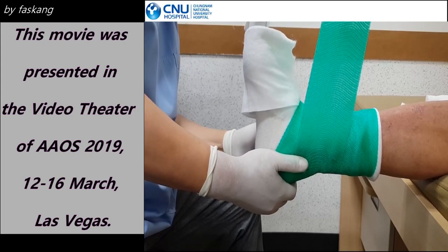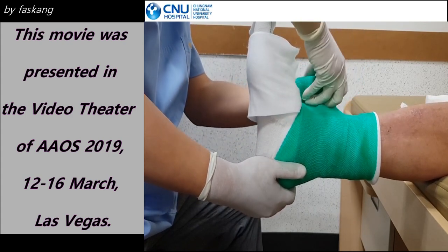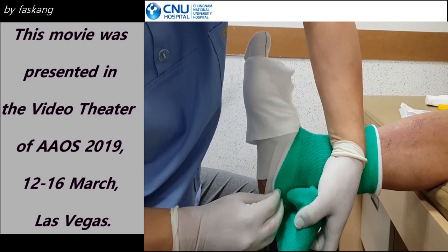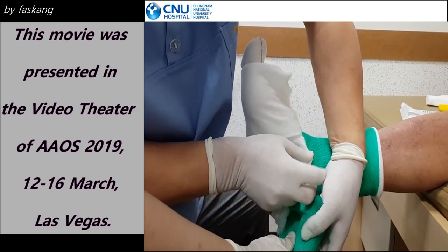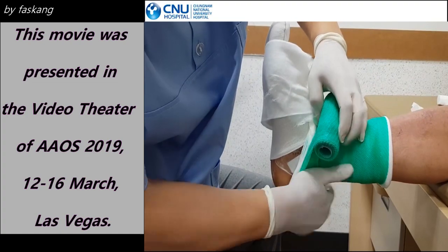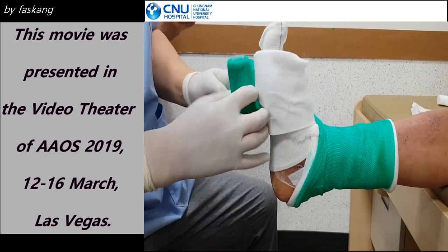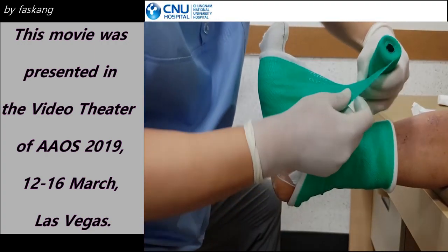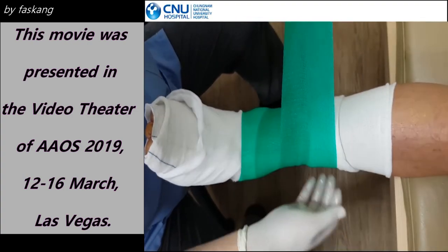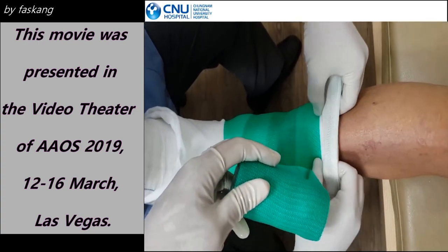The distal end of the lower leg is managed in the same fashion, including the Achilles tendon insertion site. By palpating the medial and lateral malleolus, the margin of the cast fully covers them. The same procedure was recorded from a different view. When managing the proximal margin, the assistant holds the cast during the procedure. You can see the modification of the sleeve and cotton during the polyester cast covering process.